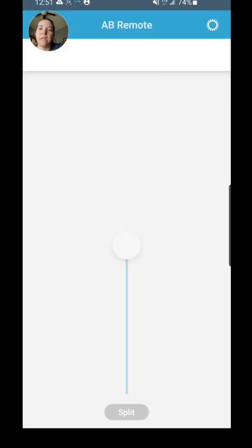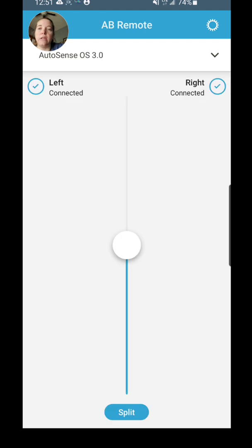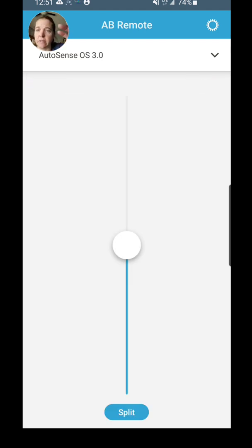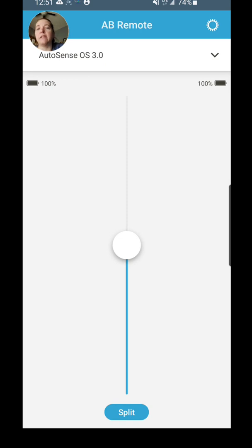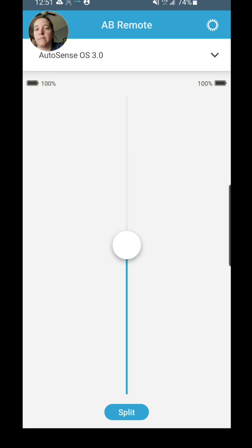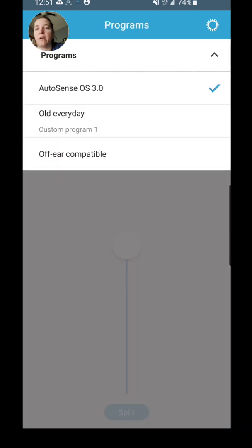So now I'm connected. I'm going to hit Continue and we'll just kind of go through some of the options that are available here. This first window that you're going to see at the top, you'll see the AB Remote, you'll see which program you're currently on with a little drop-down chevron there.